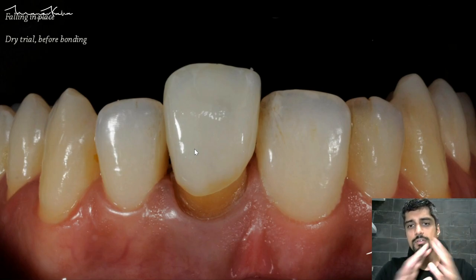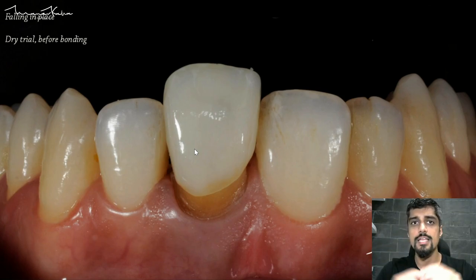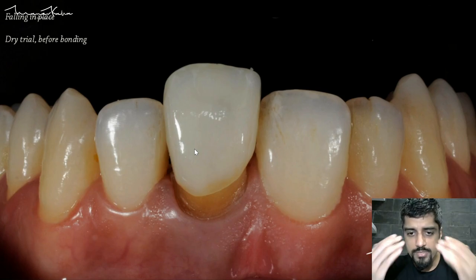Don't use any gel. Dry the tooth. Don't have any saliva, because even any amount of saliva around this area is going to impede your visibility and you're not going to be able to see how well or not this restoration fits.